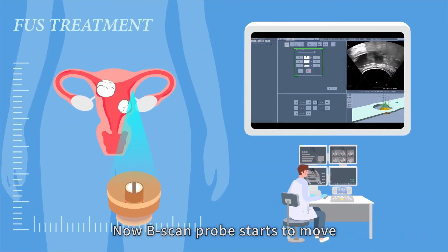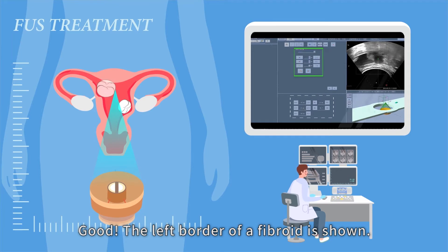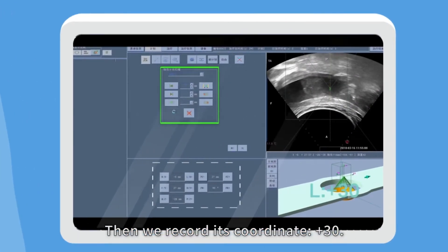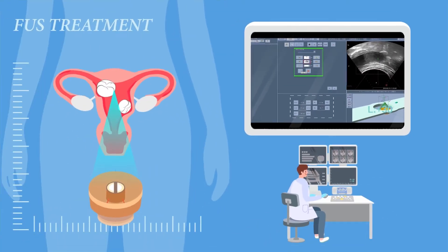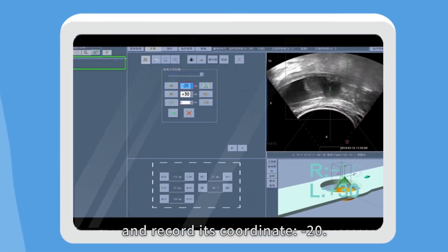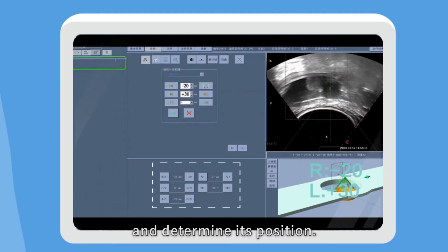Now the B-scan probe starts to move from the left side of the womb. The left border of the fibroid is shown. We record its coordinate: plus 30. Then we move the probe to detect the fibroid's right border and record its coordinate: minus 20. That's how we find a five centimetre fibroid and determine its position.